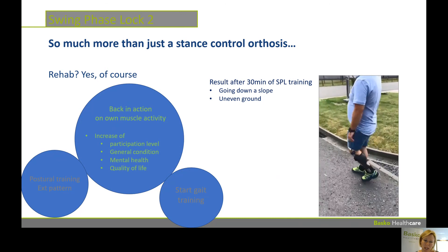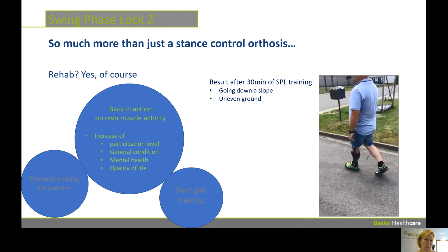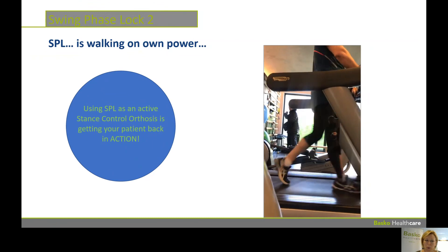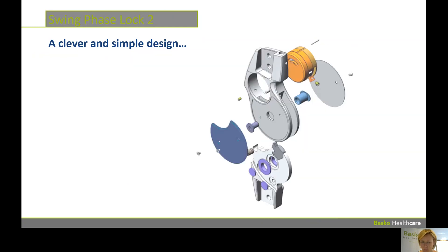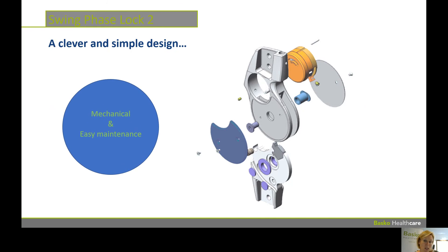By giving that, you will increase the participation level, you will increase the general condition of people, mental health and quality of life. Basically, SPL is walking on your own power — we are really using SPL to get people back in action with their own muscle activity. Clinically it's a beautiful system, and technically as well. As you can see here in that exploded view, there are not many parts and as it is a mechanical system, it will be easy to maintain.